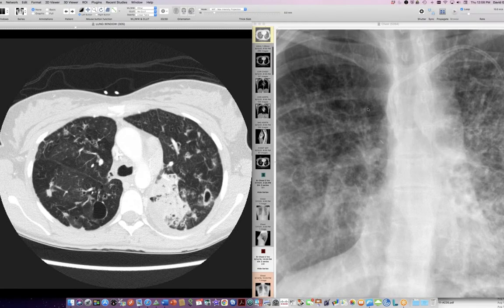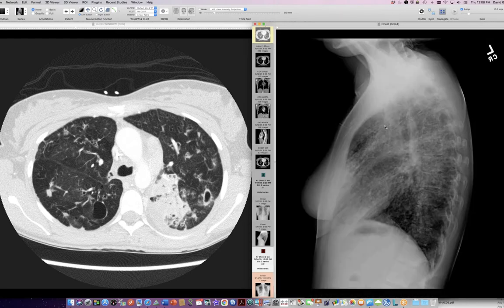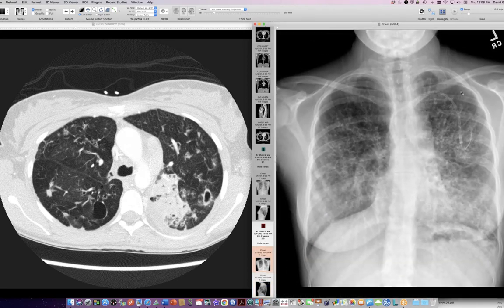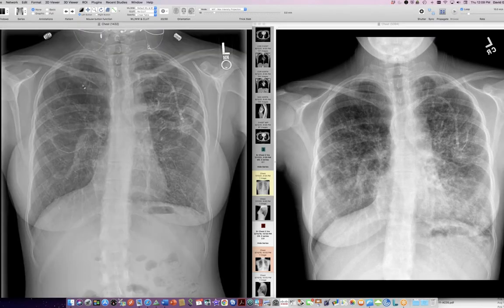All right, just curious. Okay, so let me show you this other patient here who also has cystic fibrosis. And you can see that back in 2019, the time of this radiograph, she has truly messy lungs. Let me shrink this down here. So really horrible looking lungs. I think she was also put on Trikafta. And so her current chest radiographs look a whole lot better. So let me show you the July radiograph. You can see that all that mucus plugging has really decreased substantially. So all these blobs out here in the old radiograph are gone currently.